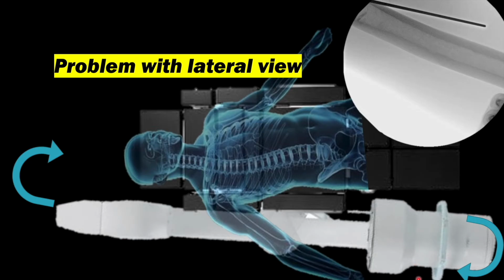He will have to come outwards near your equipments, instruments and operating trolley, which is going to create a problem. So we don't want the operating part of the C-arm and technician in this zone. That's why it's better to keep your C-arm at the head end, because it will provide good space for the technician and the operating part of the C-arm, and the only part you'll be getting in this area is the terminal part of the C-arm. That is not going to take much space and it will be easy to get the axial view. So this kind of view we will be getting if the C-arm is placed like this.